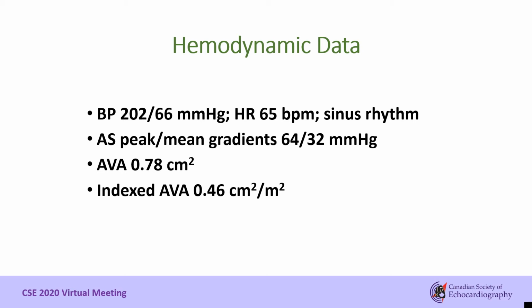The hemodynamics are summarized on this slide. The aortic valve area and indexed valve area were based on a left ventricular outflow tract dimension of 2 centimeters.